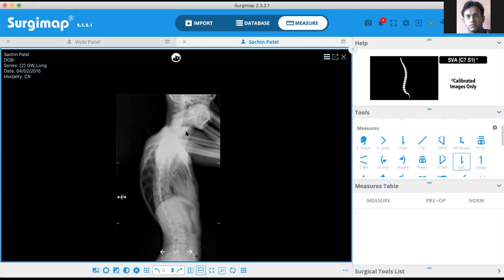Yes. But will that not stretch the spine? Like will it not put the spine? It is actually not. See, the only thing is the patient should not bend the neck. You ask them to stand straight and hold the hand behind. So that takes the shoulder out. You can see it better. Especially in a pendulous one. It's much clearer. Not the perfect way like an EOS, but still it's better. Okay.